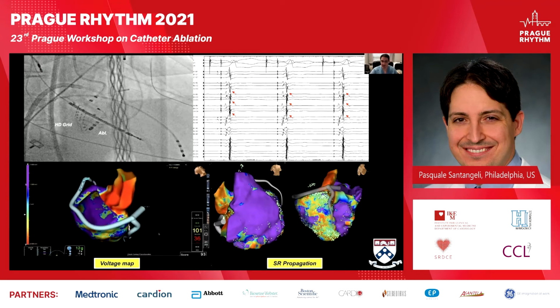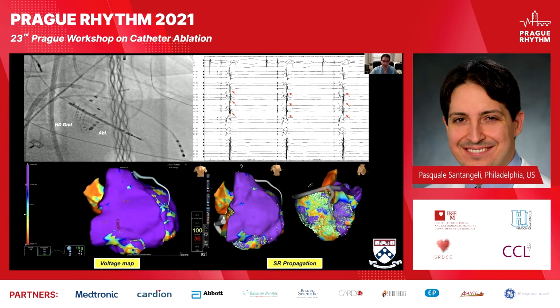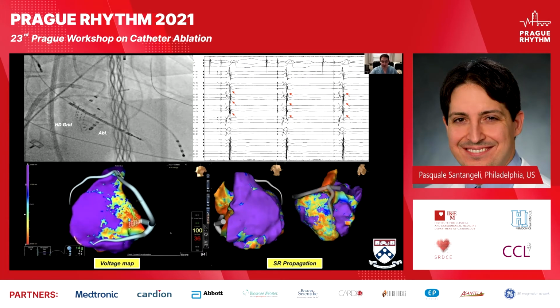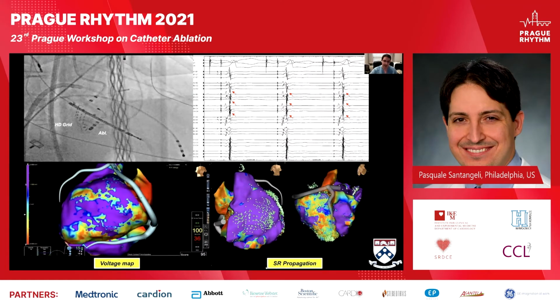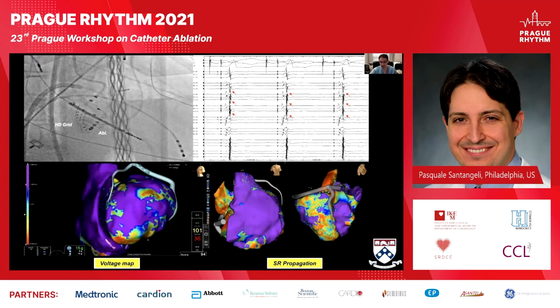In patients with biventricular devices, I tend to prefer to avoid mapping in BiV pacing, which is a collision wavefront. We see the limitations before, and occasionally it may be problematic to annotate timing, but also to see abnormal electrograms. In this case, to prevent acute decompensation, which was seen occasionally with RV-only pacing, we mapped with LV-only pacing by programming the RV output as sub-threshold, and mapped with LV-only pacing from the CRT device. This propagation map in this wavefront didn't seem to show clear areas of conduction slowing.